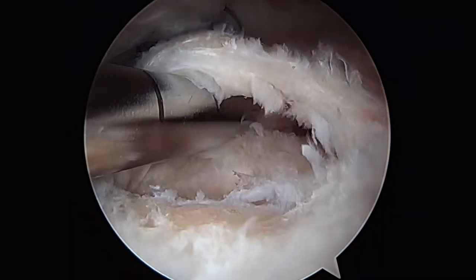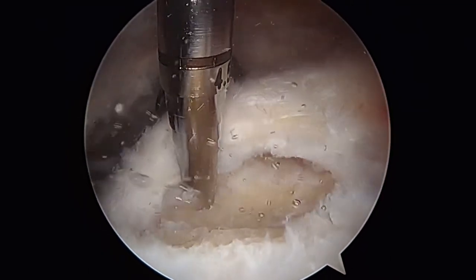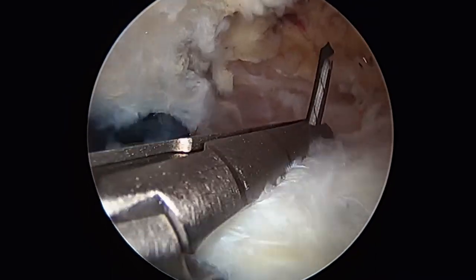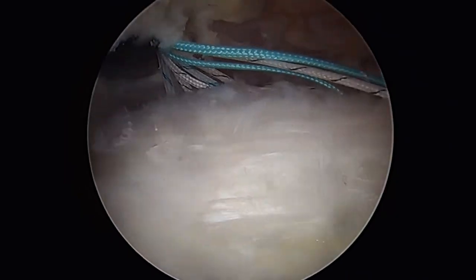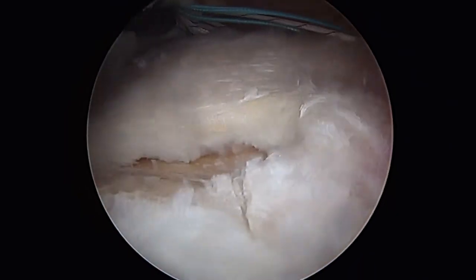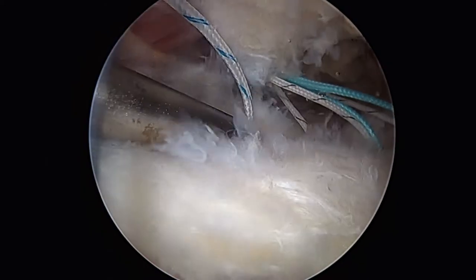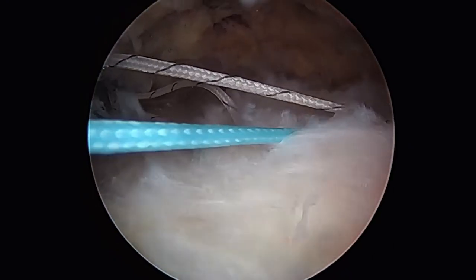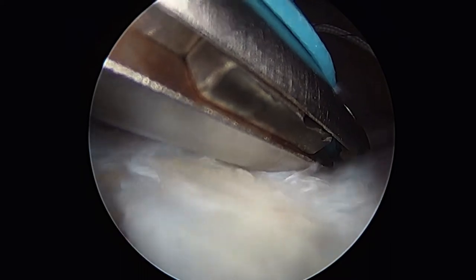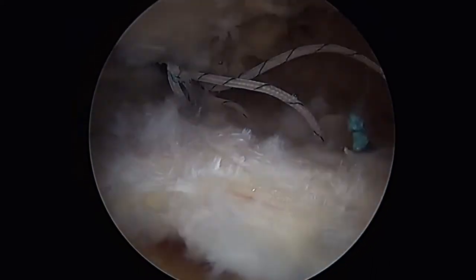The first technique will show an augmentation of a double row repair. This is a medium-sized repairable supraspinatus tear that we'll fix with two double-loaded suture anchors placed medially. We'll pass all eight sutures retrograde and take them out the anterior portal in mattress fashion, then tie down two of the mattresses for primary medial fixation just lateral to the articular surface. These sutures can be tied and cut primarily, leaving us four limbs which can be brought laterally into knotless anchors.